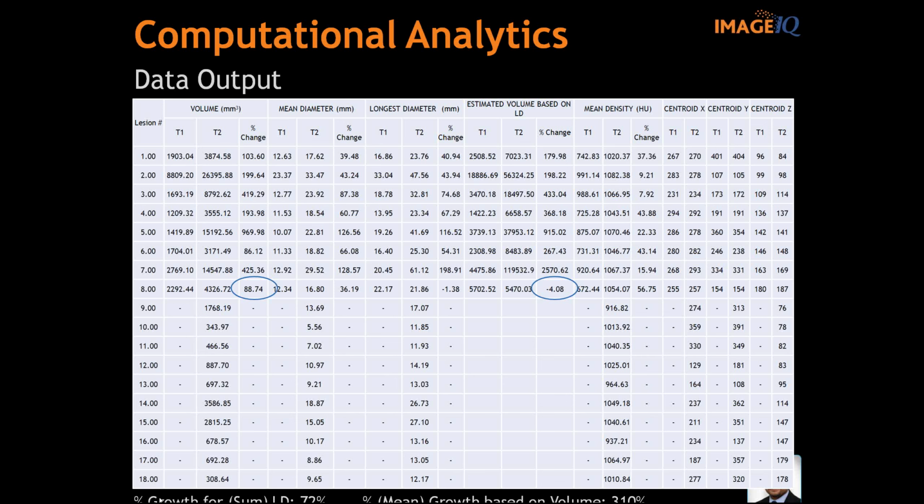Yeah. I think it's actually sort of counterintuitive to create. The reason for things like the RECIST or scoring systems that you see out there is because it's hard to get a consensus between observers, right? So you have to give them specific criteria so that you're evening the playing field. You don't have to do that when you have numbers in a quantitative output, right? They speak for themselves. You just use the numbers the way they are. Now, how you want to use the numbers is a different story, but at least now you have the option of actually diving into the data and getting out new metrics that you may not necessarily have seen before.